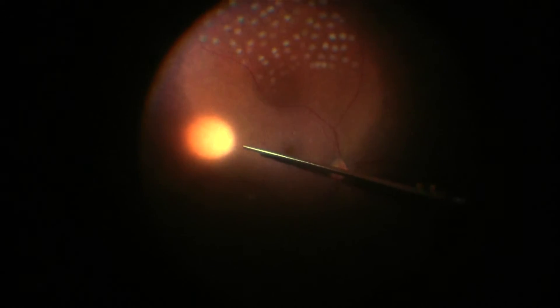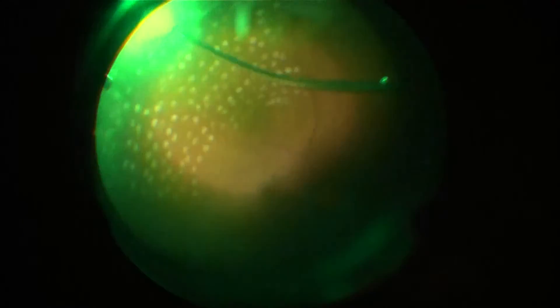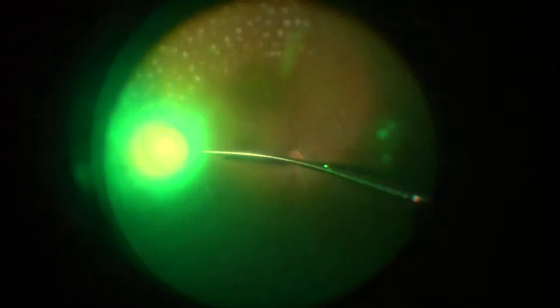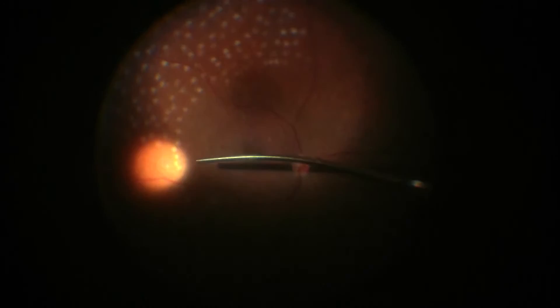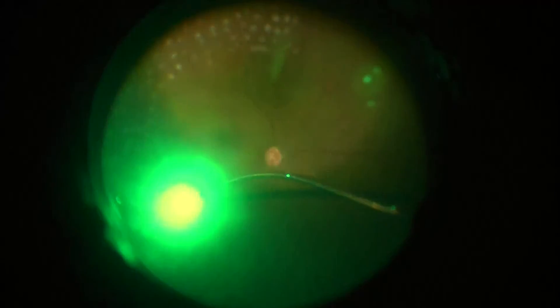Doing it with endolaser has some advantages. It's very controlled, very quick and efficient, and it's more comfortable for the patient. The probe that we're using here is a curved, flexible, illuminated laser probe. This is all in a 25-gauge system. What this allows us to do is, in a patient who's phakic like this patient is, we're able to cross over and really treat the peripheral retina. That's not possible with a standard light pipe and retractor. We can't cross more than midline. Here, the natural curve, as you can see on the instrument, allows us to get around the phakic lens and be able to do that safely without damaging the patient's lens. The laser's illuminated too, and so that allows us to have your other hand free if we wanted to, in order to help depress or to insert another instrument into the eye. In this case, we're just using the light pipe in the other eye, which is giving us peripheral illumination to further keep us oriented in the eye and keep us safe.